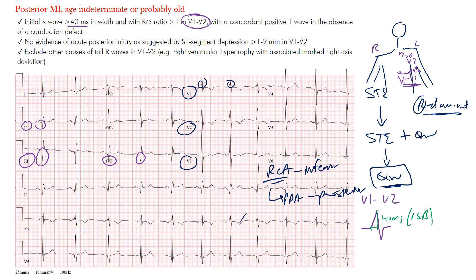Notice in the inferior leads — 2, 3, and aVF — we have these deep Q waves that have formed, which is normally what we want to see with a prior MI. A Q wave is the first negative deflection of a QRS complex. You want to make sure you're seeing Q waves in these leads, and clearly they're forming here in contiguous inferior leads, indicating a prior inferior MI.